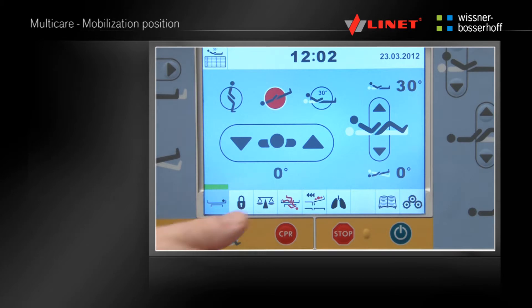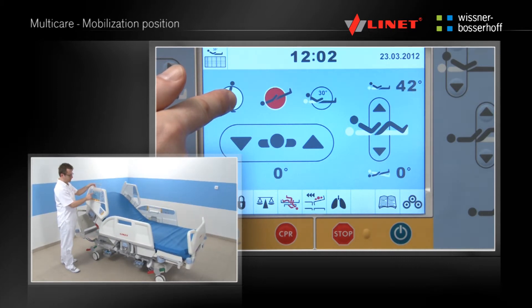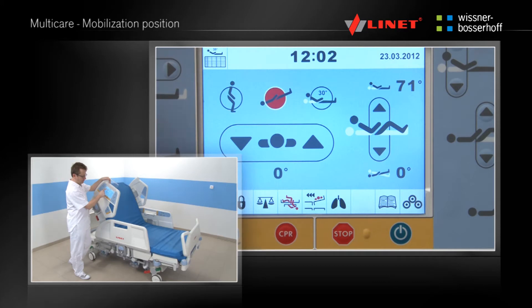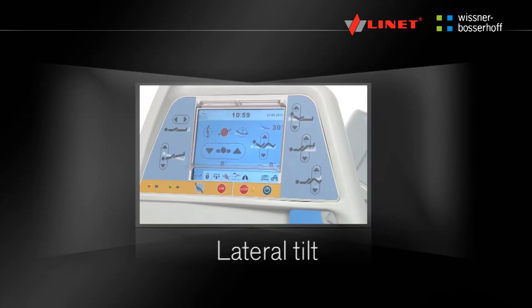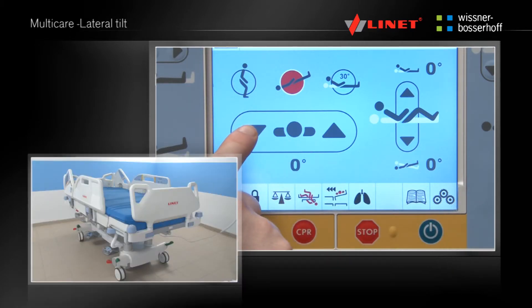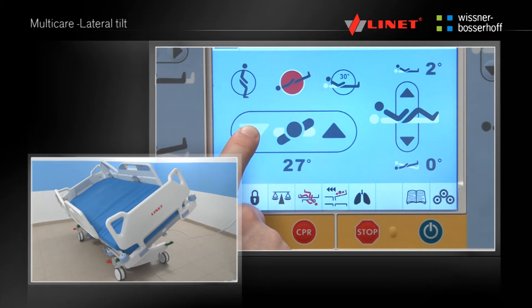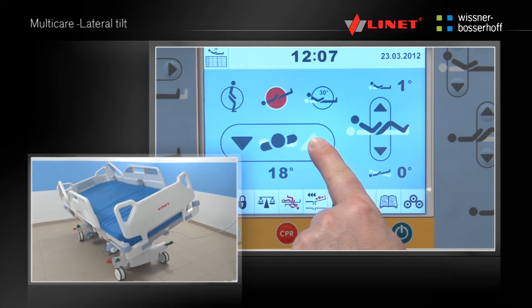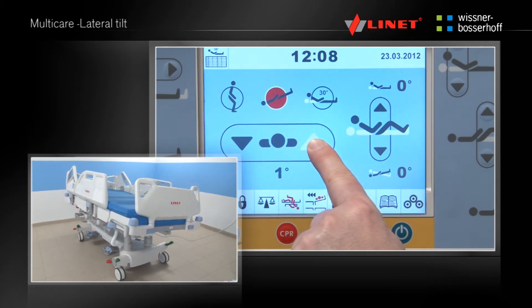Activate the function by pressing the Go button. Press and hold the function button until the mobilization position is reached. The backrest is positioned to the maximum angle so that the head side rail serves as a support for the patient. At the same time the bed is positioned to the minimum height so the patient can stand up with ease and safety. A lateral tilt up to 30 degrees can also be achieved; tilting is interrupted when the angle reaches 0 degrees.